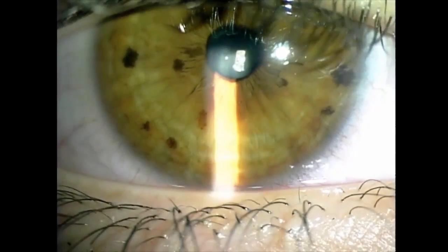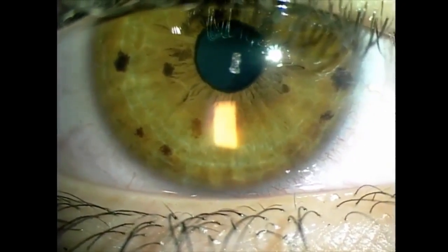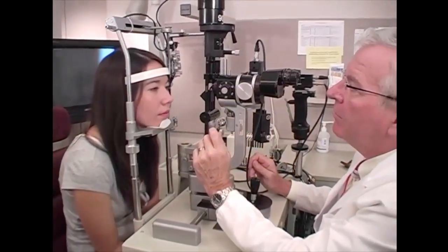So I want a dark room and a short beam of light, because as light floods the pupil, it opens the angle. And you can see that in this gonio video. Quite a narrow angle, but as I open the light up and shine it into the pupil, it causes the angle to open. So a short beam of light, dark room. I'm not flooding the eye with light, because that's going to change the anatomy.